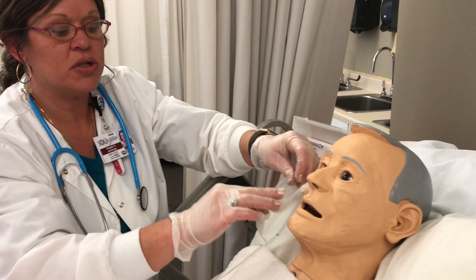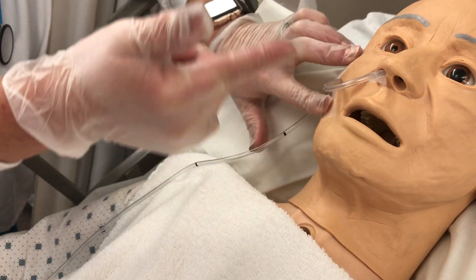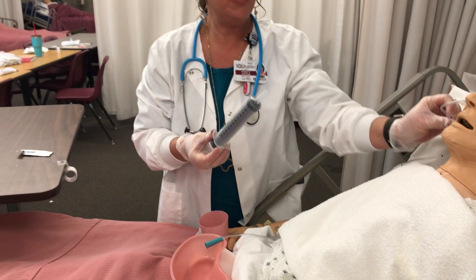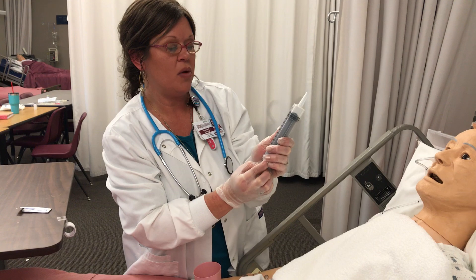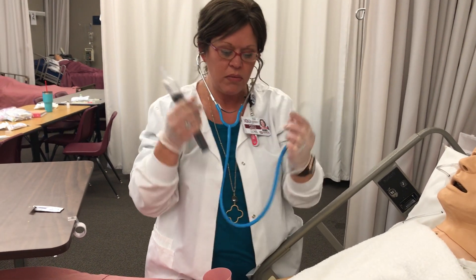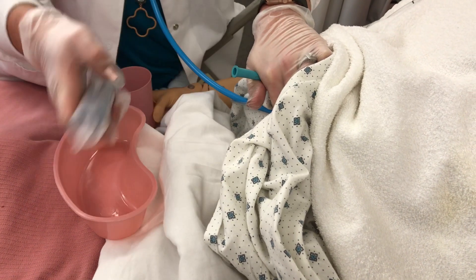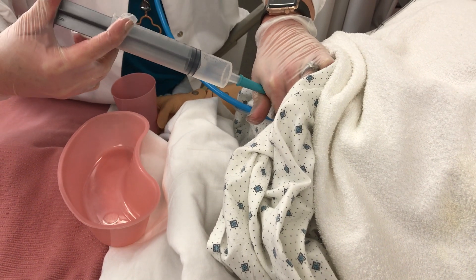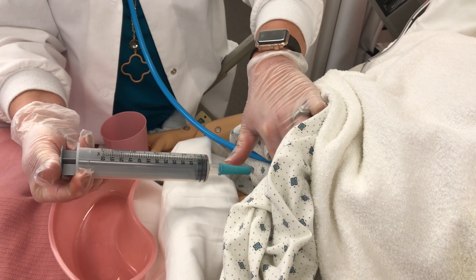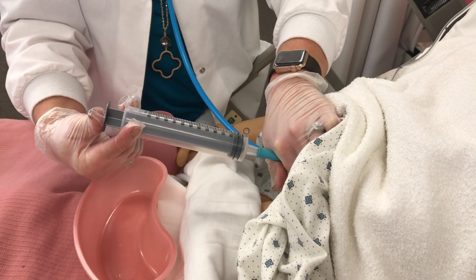Now we're going to check placement first. I'll lightly tape this here just to keep the tube in place while we verify placement so it doesn't come out. To verify placement, you can do 10 to 30 milliliters of air — we're going with 20 milliliters. I'm going to place my stethoscope in the epigastric area and push the air in one motion, listening for the whooshing sound. I heard it. So now I'm going to pull back for stomach contents, look at the color, make sure it's okay, then give it back to your client slowly.